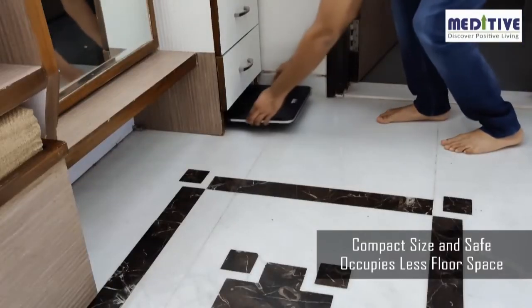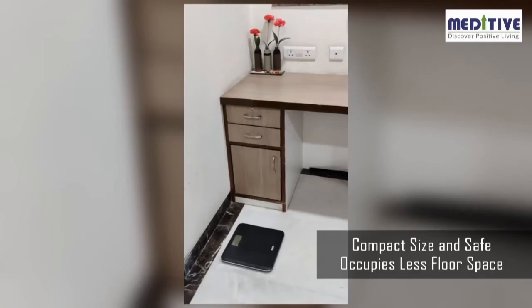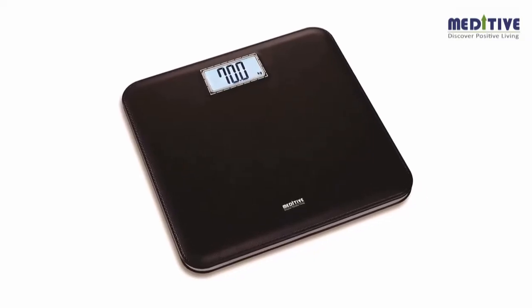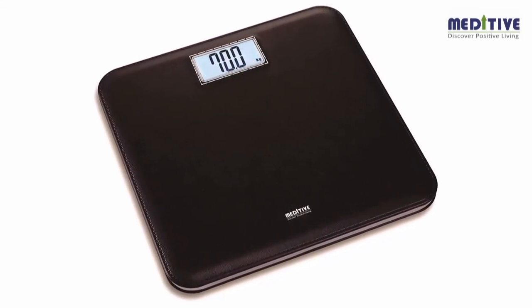This scale is compact in size and hence occupies less space on the floor in your room or bathroom. You can continue to keep it on the floor and there is no need to pick up the scale daily. We hope you like our product. You can always reach out to our customer care number for more assistance.